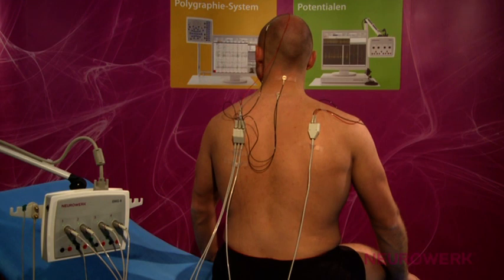The attachment of the recording electrodes, in this case gold cup electrodes, might take place while the patient is seated. The skin on the recording place is first exposed and disinfected with alcohol. If necessary, the skin surface should be prepared with an abrasive skin cleaning paste. The application of the surface electrodes takes place through a conductive adhesive paste that must be attached tightly to the skin without there being any entrapped air.